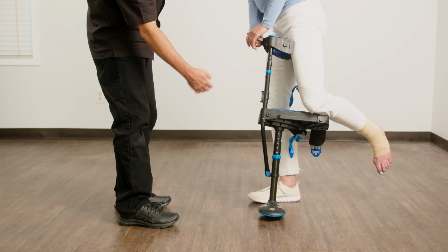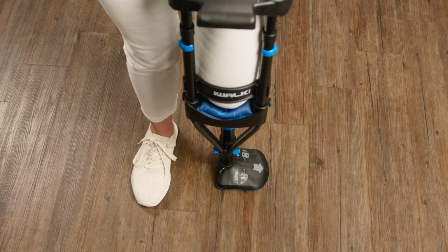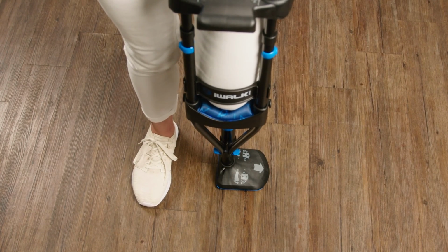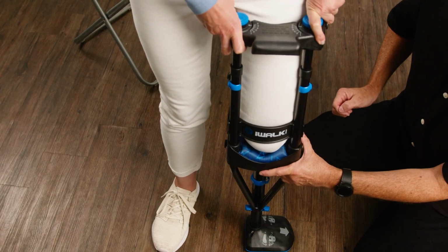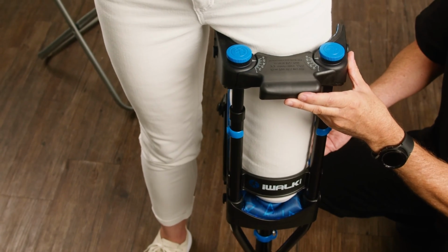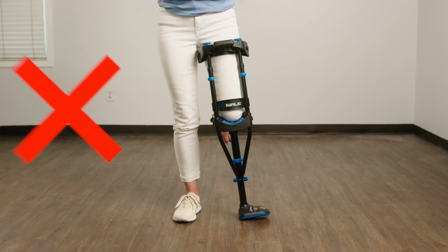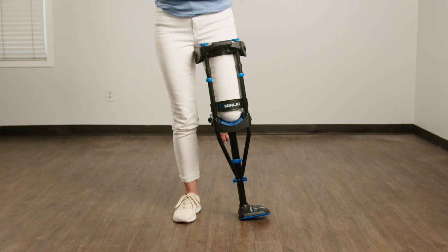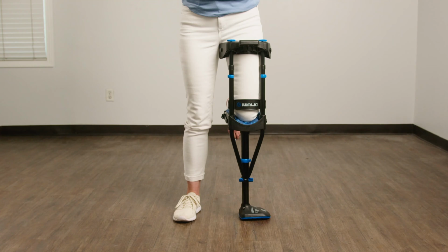To start the process, have the patient kneel on the crutch, holding the handle. Their feet are positioned side by side, hip width apart. Their leg is firmly against the gait strap, and back of the handle is firmly against their thigh. Weight must be evenly distributed 50-50 between the good leg and the iWALK leg. The patient will instinctively place most of their weight on the good foot, so correct this as often as needed.